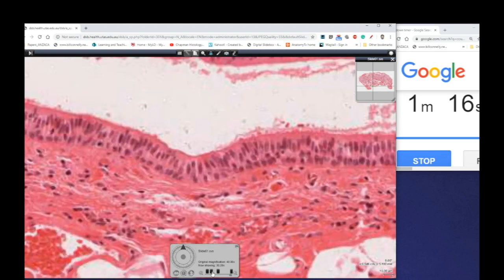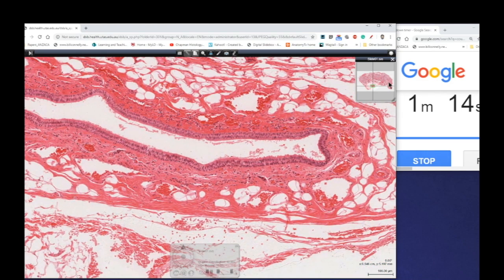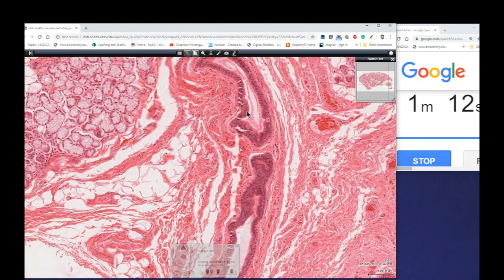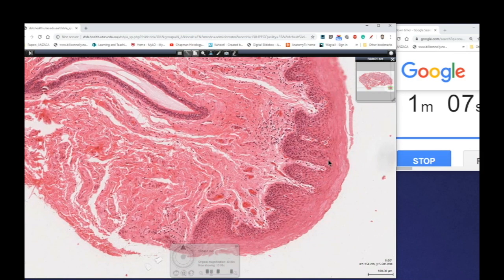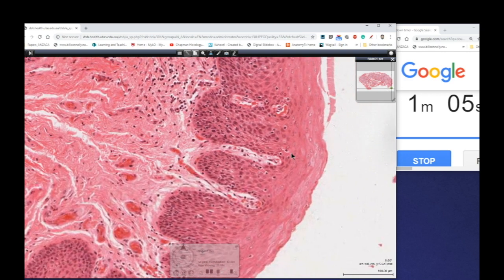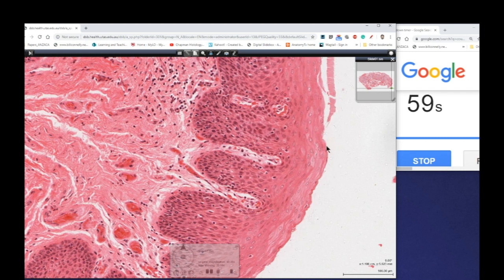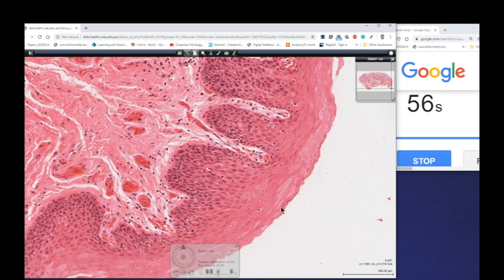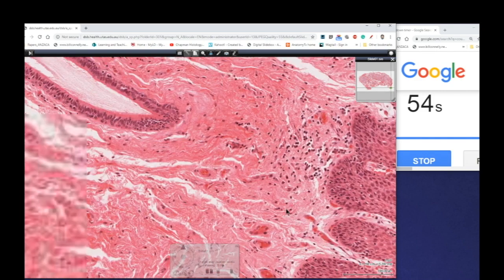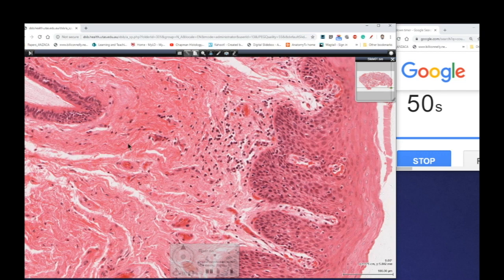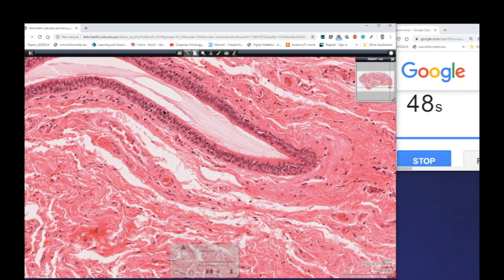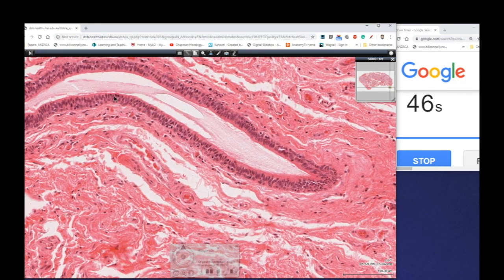If we zoom out a little bit, we can actually see on the right-hand side here this duct winding its way towards the surface. Here's our surface epithelium — if you remember your epithelial classifications, this is a nice thick epithelium. This is a stratified squamous, non-keratinized epithelium. We can see nuclei all the way to the surface. But this is the duct that's emptying its salivary secretion onto the surface, and we can see this stratified columnar type of epithelium.